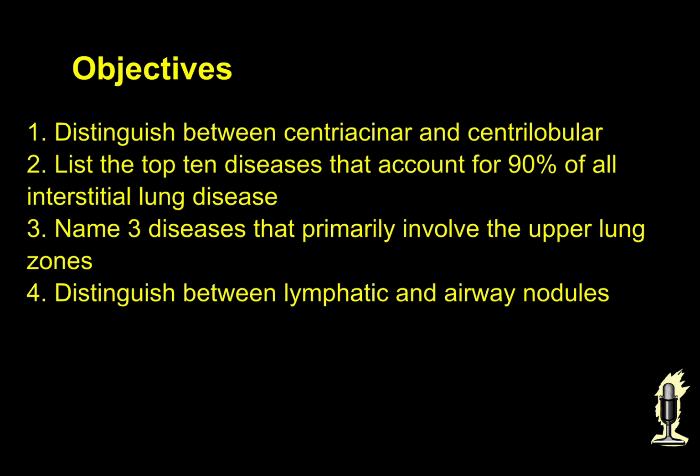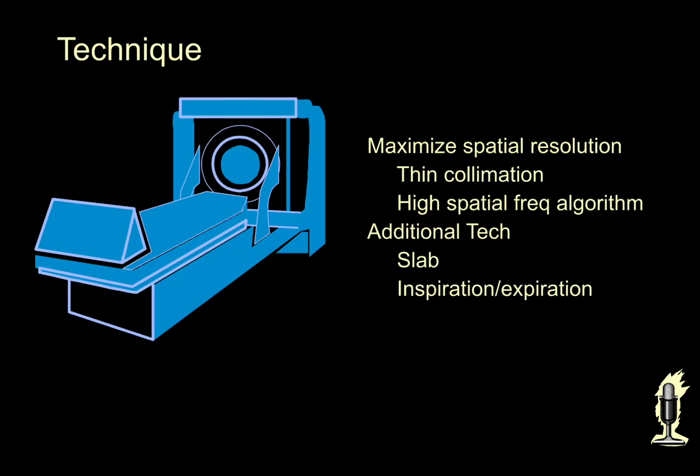At the completion of this lecture, you should be able to answer the following objectives. HRCT is a technique designed to maximize spatial resolution: thin collimation and reconstruction with a high-frequency algorithm. Additional techniques are illustrated in the HRCT Expert found in the practice section of this site.